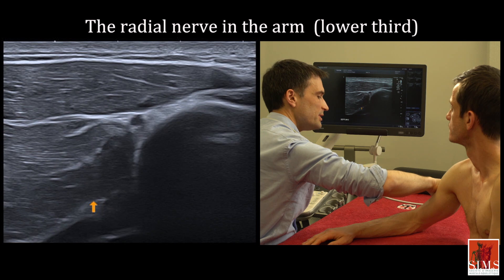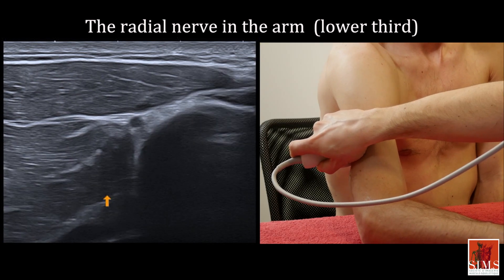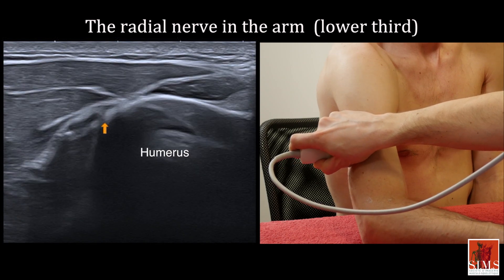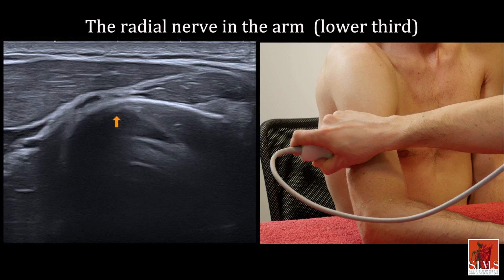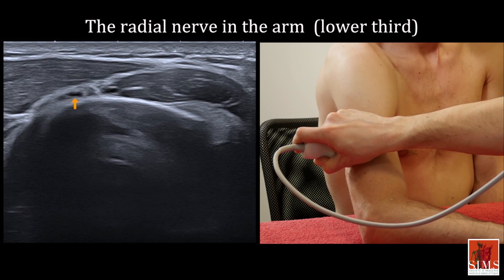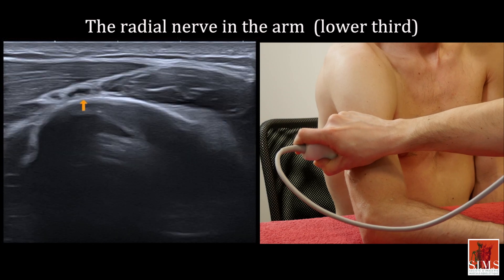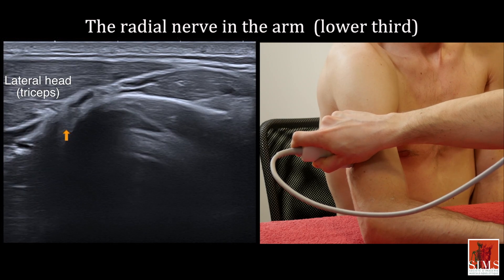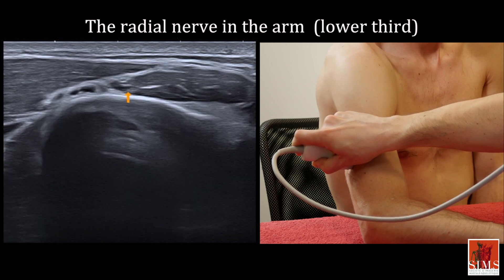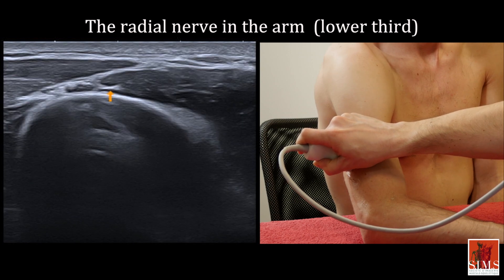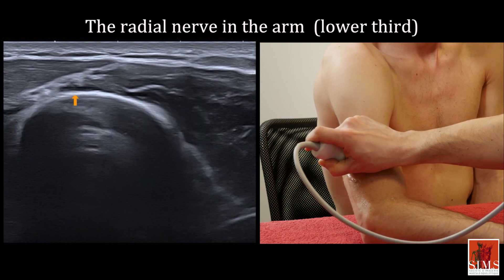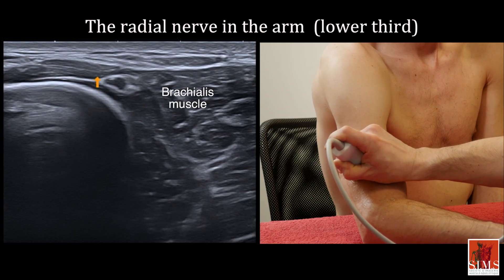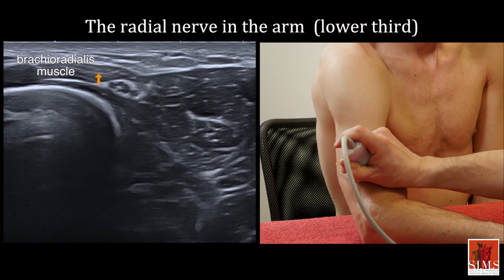The examination continues by positioning the transducer on the posterolateral surface of the upper arm, where the radial nerve is again seen in contact with the bone cortex. It then comes to the lower third of the anterolateral surface of the arm, piercing the lateral intermuscular septum between the lateral head of the triceps brachii and the brachialis, indicated here by the arrow. The radial nerve is then clearly seen between the brachialis muscle and the brachioradialis muscle, here in a superficial position.